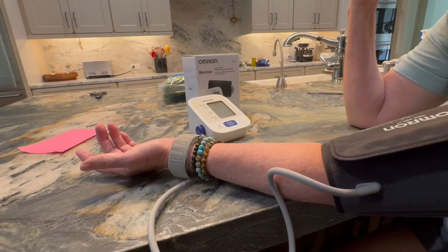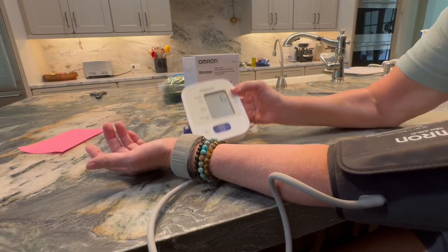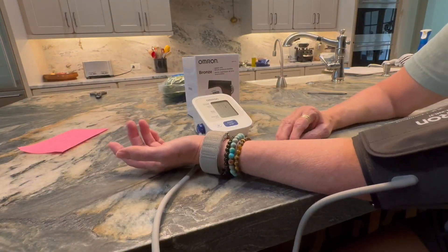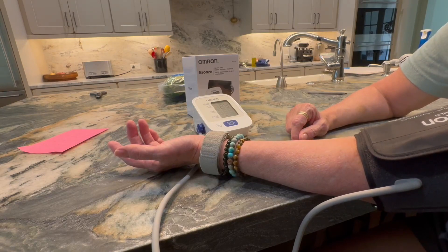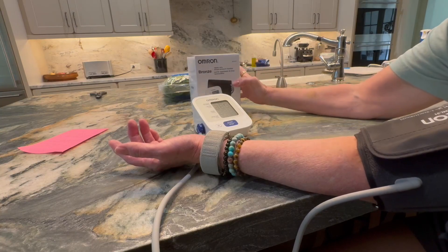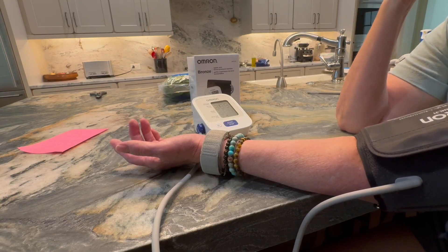Push the button just like this and it'll make a humming noise when it is reading your pressure. It takes about a minute or so to read your pressure and your pulse. The box also has a lot of good information on it, and it comes with an instruction manual as well that explains things to you.